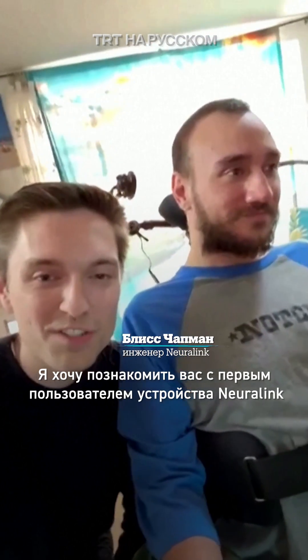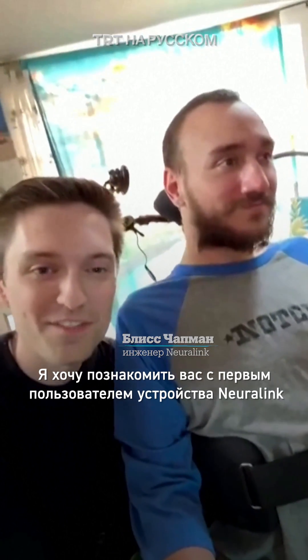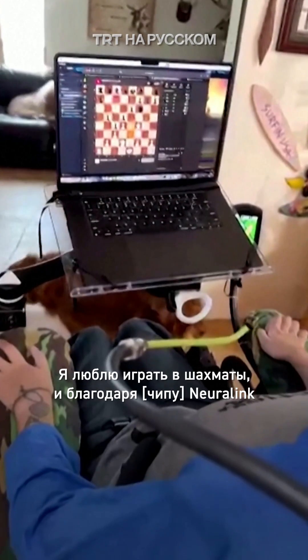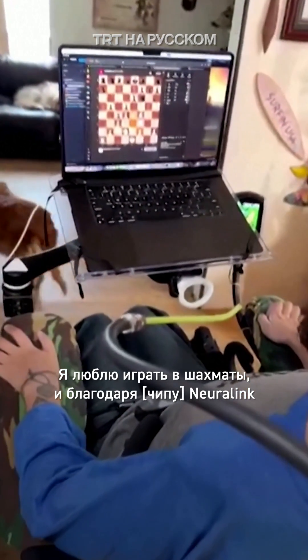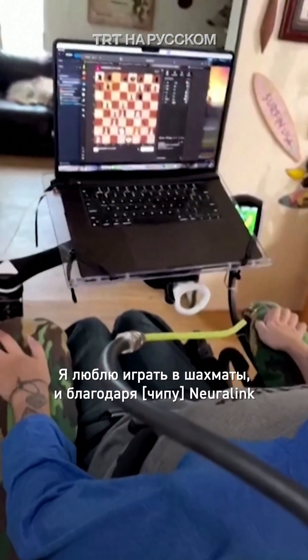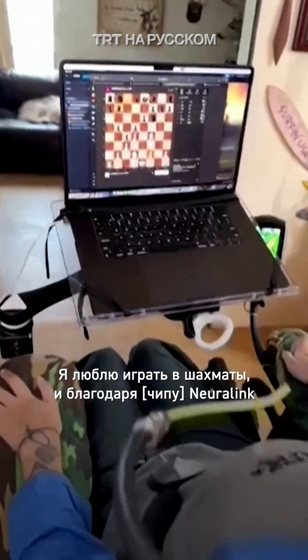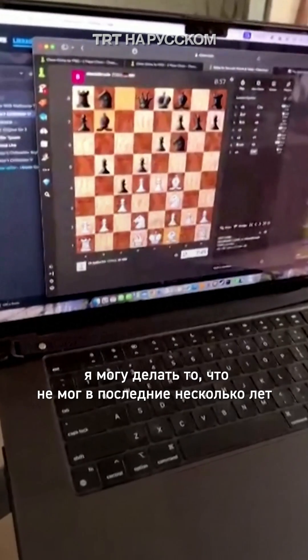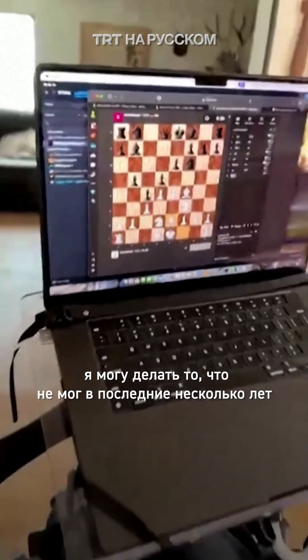I'd like to introduce you to the first ever user of the Neuralink device. Do you want to explain a little bit what's going on here? Yeah, so I love playing chess and so this is one of the things that y'all have enabled me to do — something that I wasn't able to really do much the last few years, especially not like this.